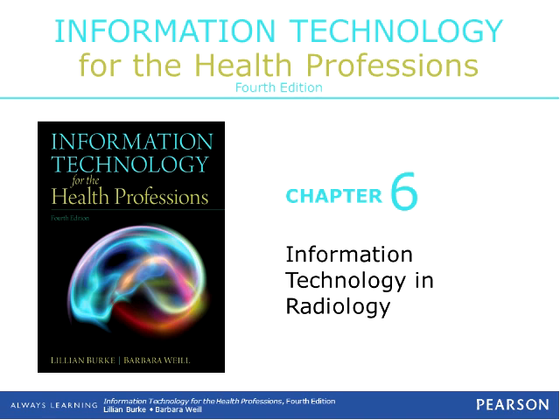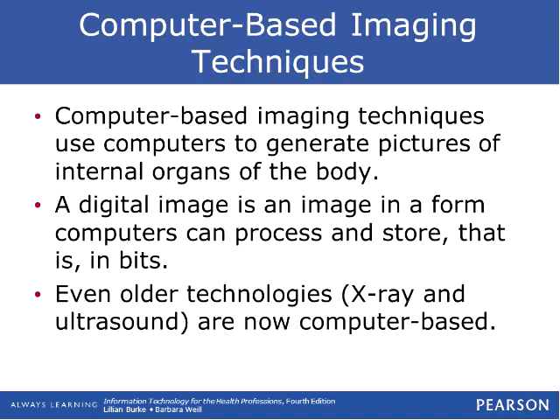This is the recorded lecture for Chapter 6 for Information Technology for Health Professionals. And we're going to look at information technology specifically in the area, the arena, if you will, of radiology. And information technology has changed radiology significantly from the old mechanism of films and development solutions and such into a digital format. And we're going from that to the PACS systems that are really making radiology a much more efficient process.